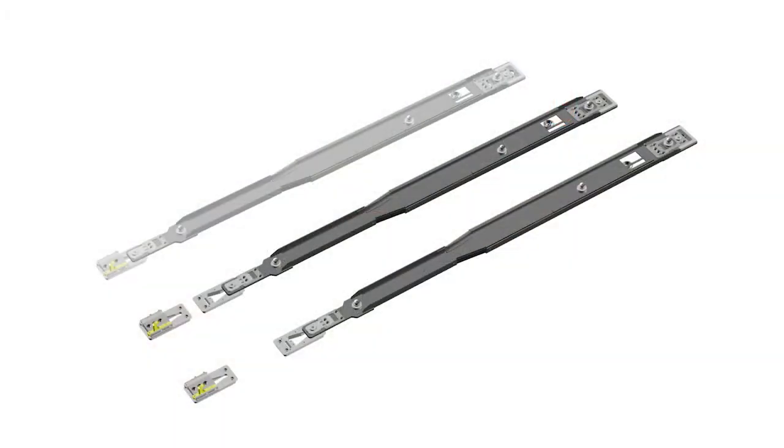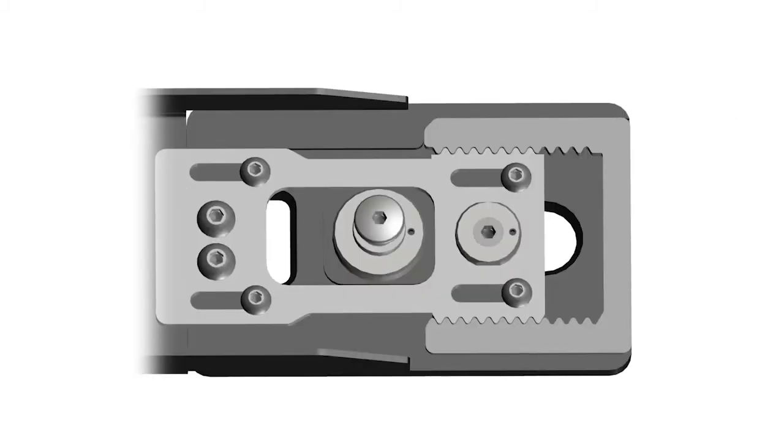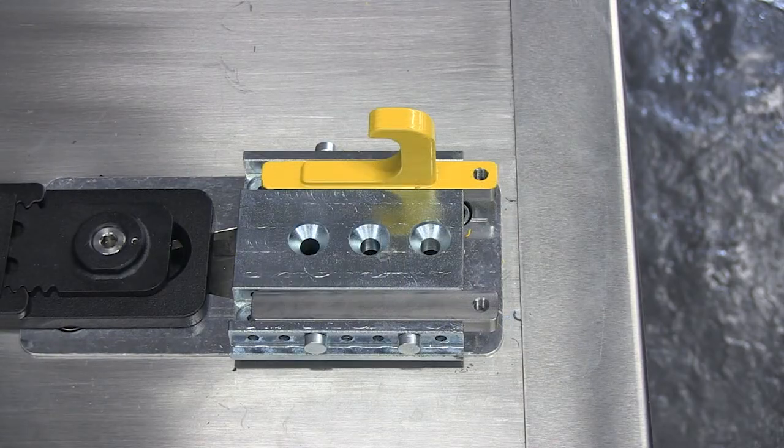The inline medium and inline long each use three floor mounting blocks. With the medium and long, the mounting rail mounts to the two blocks toward the front of the vehicle. The safety hook mounts to the mounting block at the rear of the vehicle.